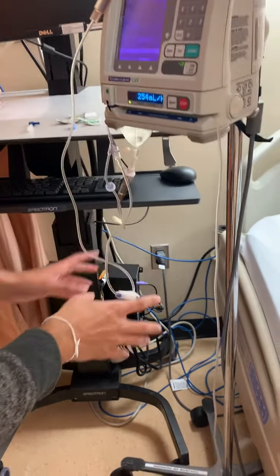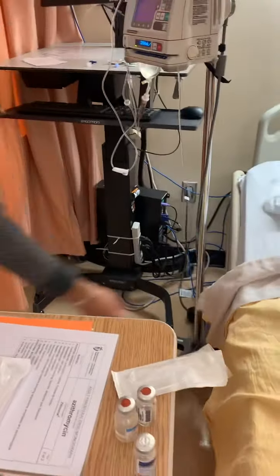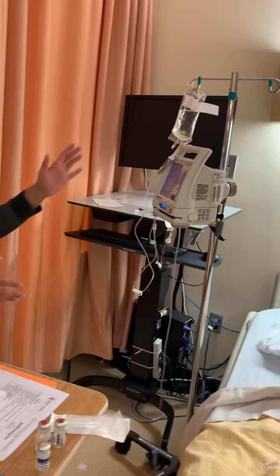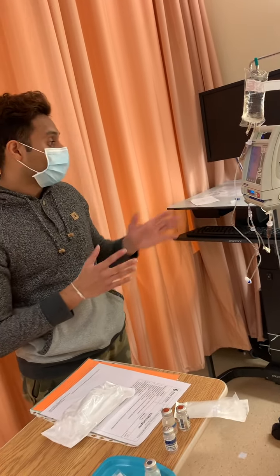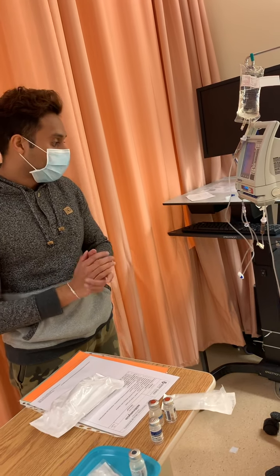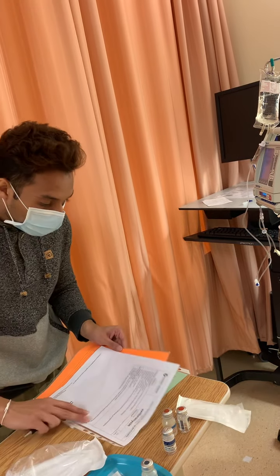And we're checking, ensuring everything's open, so we're unclamping this, so it's all good. Everything's unclamped. Everything's on plan, so you know it's infusing well. And I'm gonna make sure to come back after the medication is done infusing to flush, and program a 15 mL flush on the pump so that the patient gets a full dose of the medication. I'm gonna make sure to document on the fluid ins and outs sheet after I leave. I'm gonna document on my MAR that I gave you the medication.